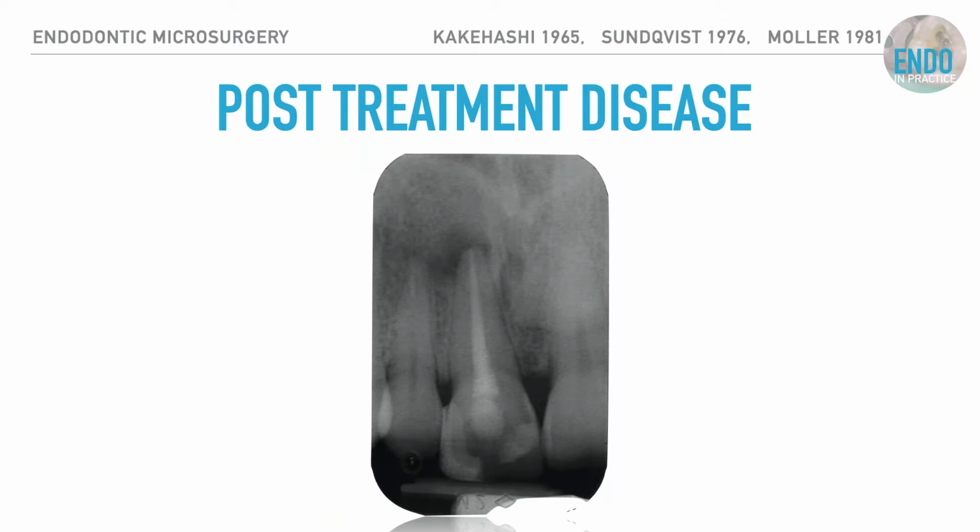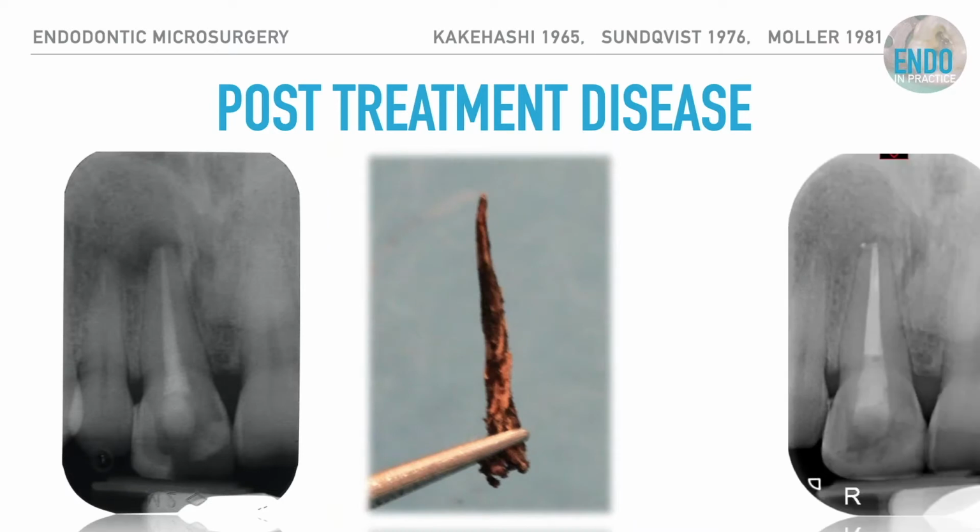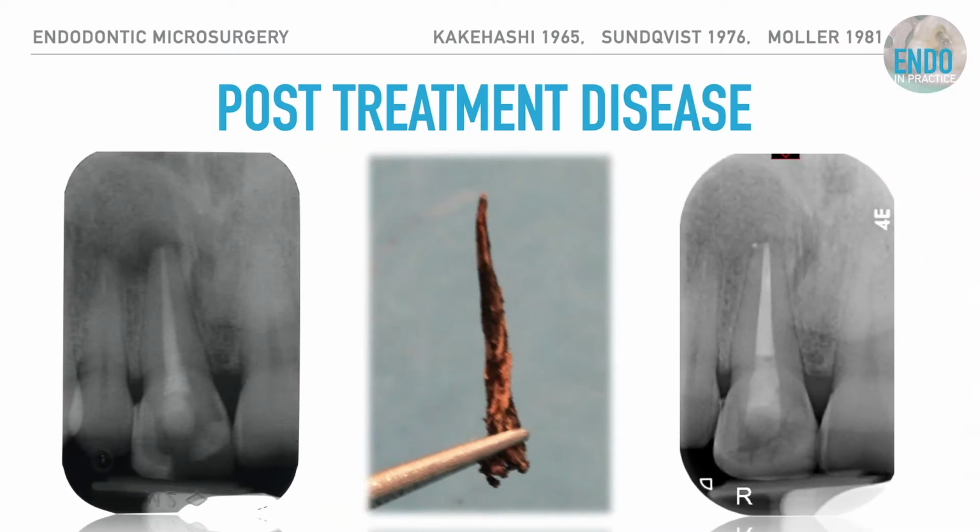But we all have internal biases. We all have things that we like to see, things that we don't like to see, treatment preferences. And really what I'm trying to demonstrate by this slide is that reading a radiograph can be interpreted from many different, pardon the pun, angles. This was the single GP point that I pulled out from that root canal system.